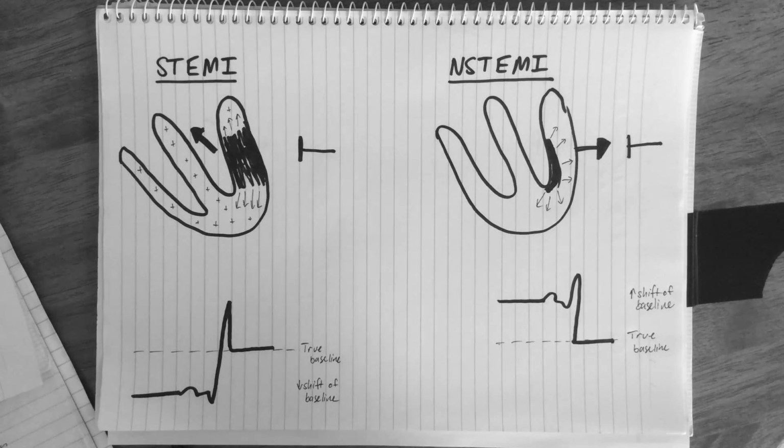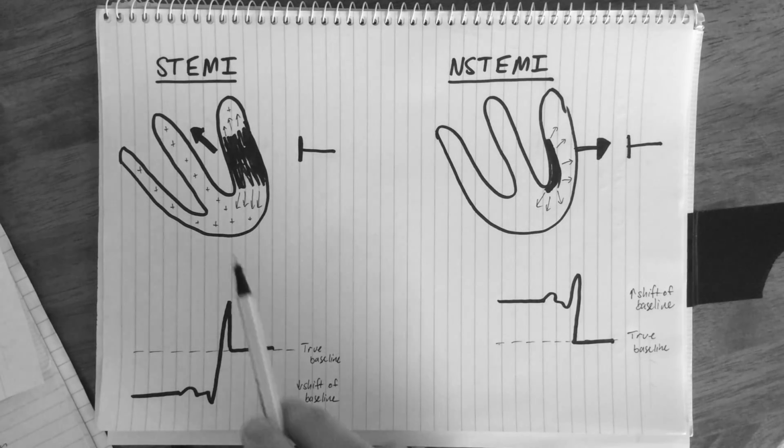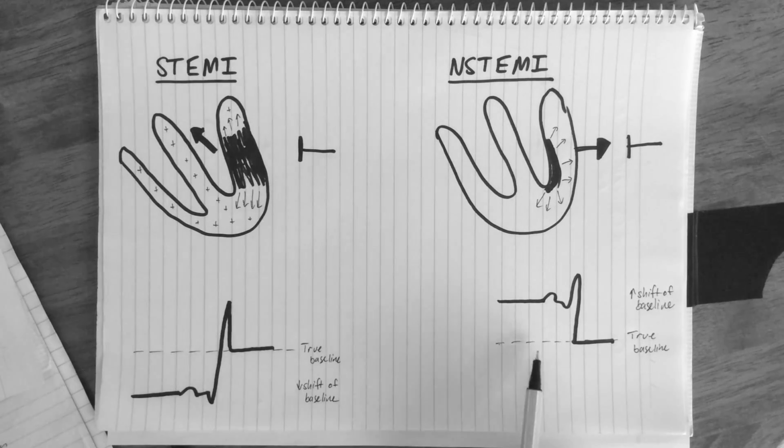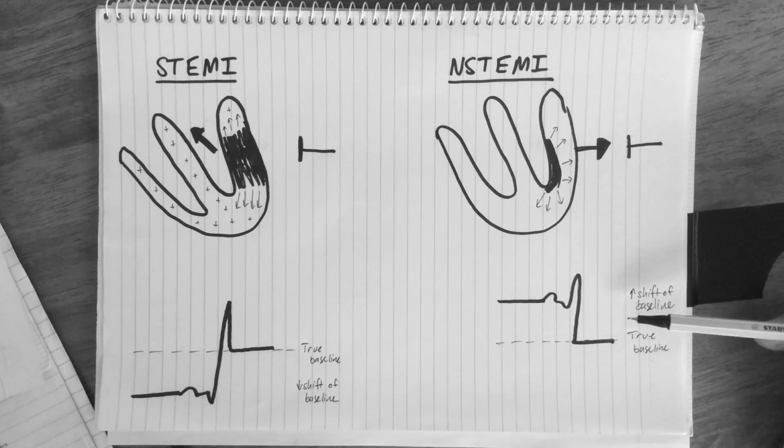One more thing to add. The ST changes are acute and will disappear over time. The reason for this is the infarcted tissue is undergoing a process of coagulative necrosis, which will eventually end in fibrosis. Fibrotic tissue does not have the ionic leakage which we saw in infarcted tissue. So there is no baseline shift. As such, the ST segment returns to normal.